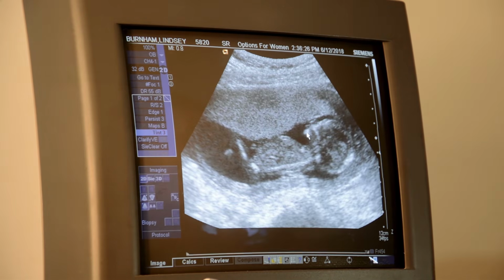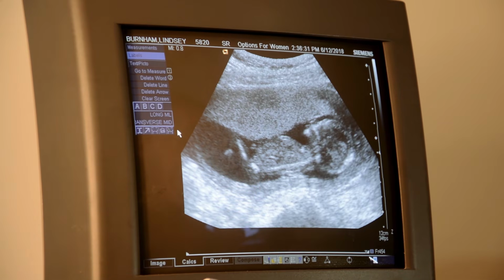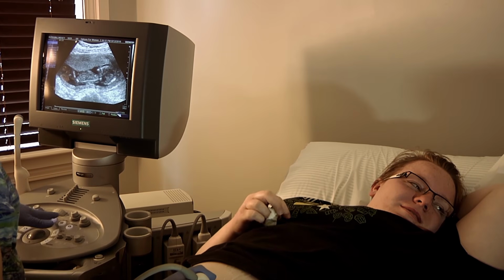Freeze. There's a good set. There you go. I like that profile. Yeah. Do you like that profile? Yeah, that's cute. Can you see it? Yeah, your screen isn't as clear as ours. Where'd the cursor go? We just hit it right here. And you can press. Where'd it go? Really? So now what? No, you're good. You're doing good.